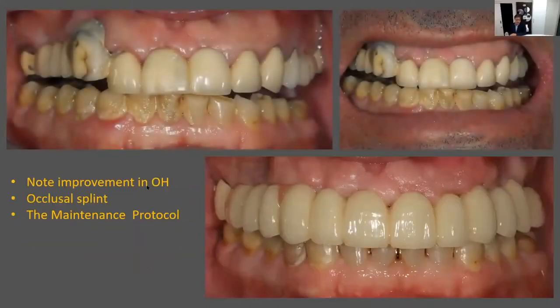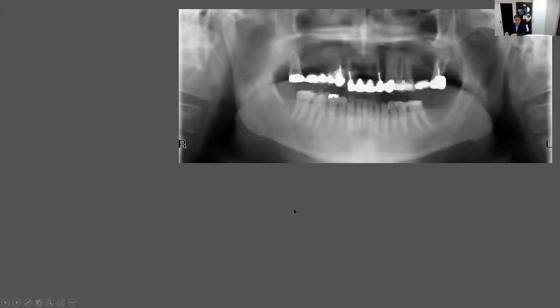Look at the situation, all right? We did the implants, and this is not zirconia. I just wouldn't do zirconia, and I'll tell you why in a minute. But this is before we improved oral hygiene and got the patient back on the maintenance program, and the whole smile line. We grafted a lot of bone, and healing, etc. And we finally got here. But let's look at the x-rays, because the maintenance protocol wasn't in place by the time we issued the actual maxillary fixed implant-supported bridge work. And this is before, when the patient started.